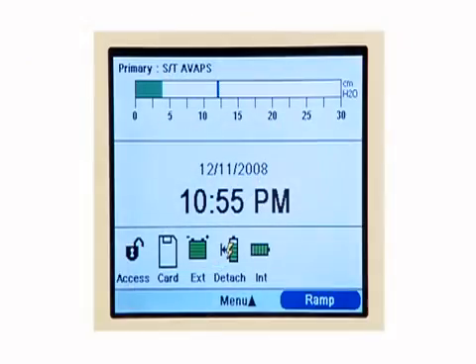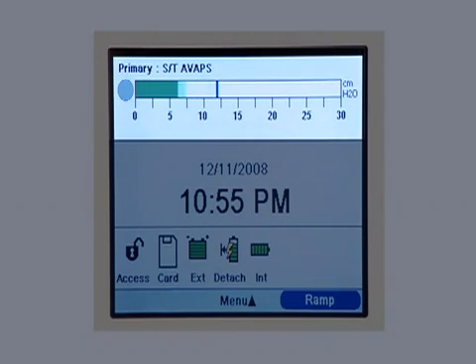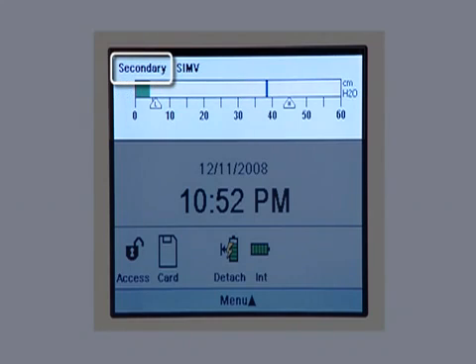On the simple display screen, the top section is called the monitor panel. It shows which of the ventilator's many therapy modes is in use. If any special features are active, an indication will appear beside the therapy mode. If the physician has ordered two different prescriptions, for example, one setting for daytime and another one for nighttime, you will see primary and secondary indicated.